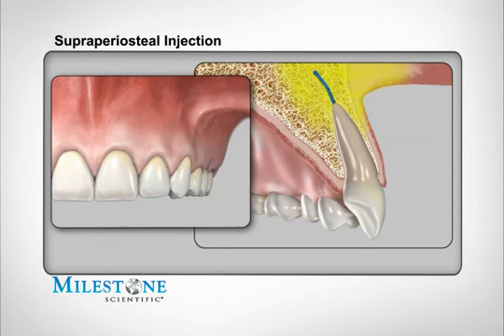The STA system precisely controls the flow rate and pressure below your patient's pain threshold level, thus resulting in a more comfortable experience. The STA system is a valuable addition to your practice and one that all of your patients will greatly appreciate.